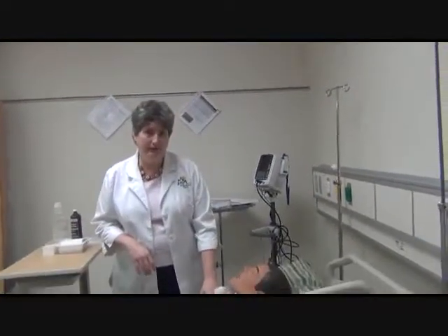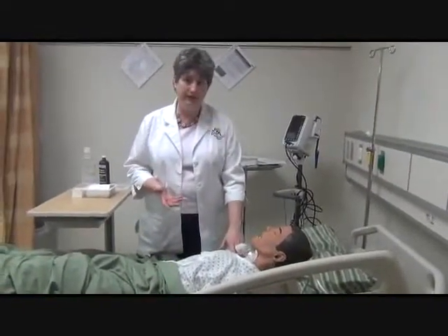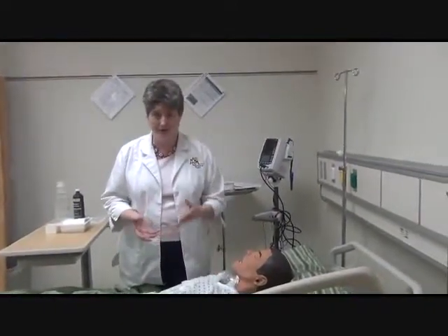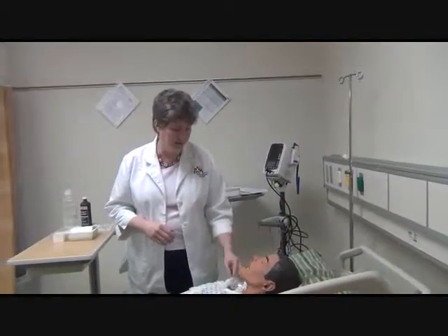I'm now going to take my stethoscope. You're going to assess for the need, so we're going to listen to breath sounds. Some of your patients are going to indicate that they need to be suctioned. Others are going to be compromised and not able to tell you that they need it. So it's up to you to fully assess.